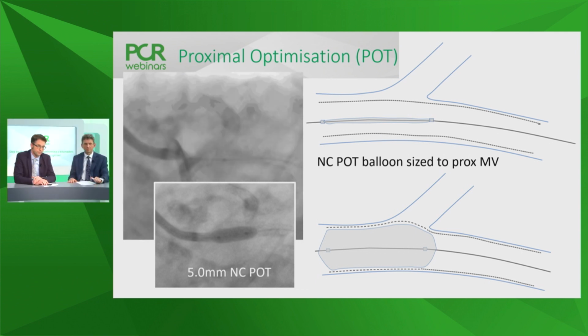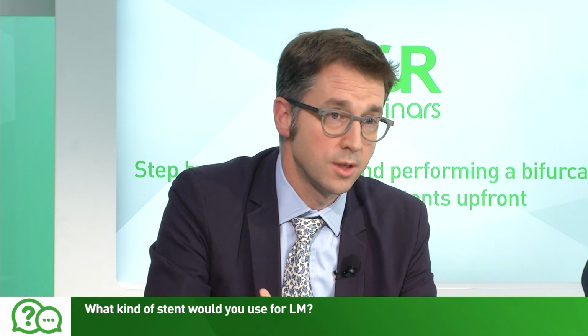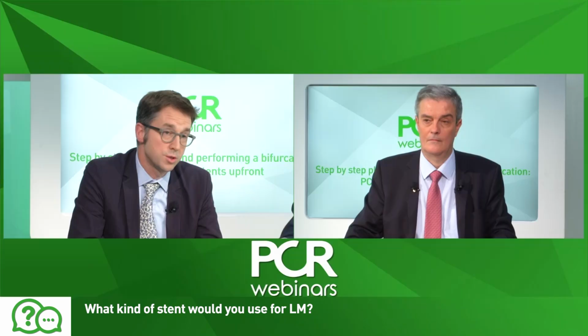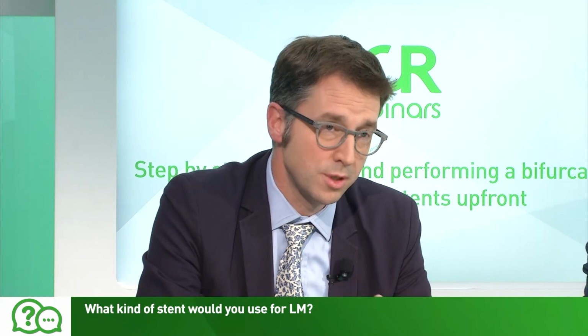Does the type of stent make a difference in this or in any technique? There is a question, what kind of stent would you use for left main? So you need to know your stents, and clearly the different scaffolds expand to different levels. The different companies have a different number of scaffolds, so you find between 2 to 4 platforms according to the manufacturer. And so a 4.0 stent in the majority of manufacturers will go to 5.8, 5.9. Obviously Medtronic with Onyx have a stent that will expand to 6 millimeters in the largest stent, but you absolutely need to know the stent you're using and the capacity it has to expand.